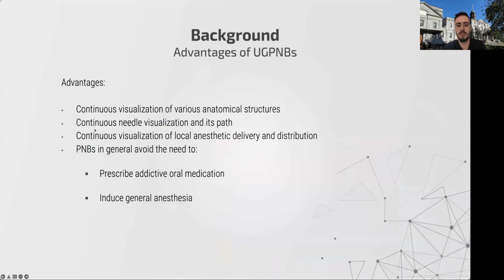This is great because it offers continuous visualization of various anatomical structures. Needle visualization and its path is also offered, as well as the visualization of local anesthetic delivery and its distribution. Peripheral nerve blocks in general avoid the need to prescribe addictive oral medication and induce general anesthesia.